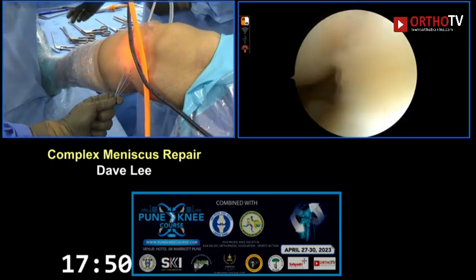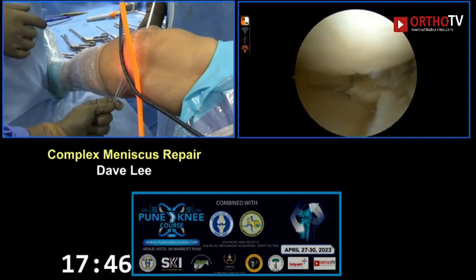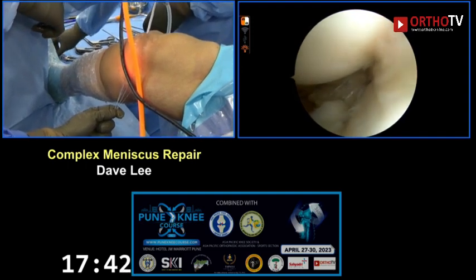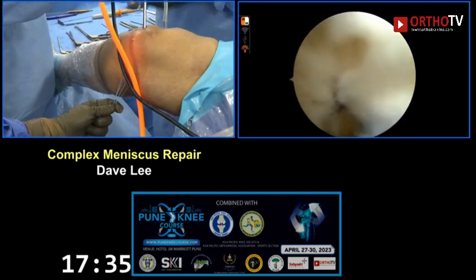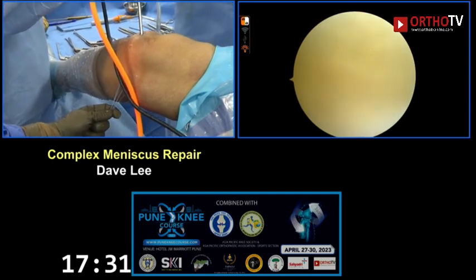Okay. Can we just have the inside? Usually I would do sort of three on the top and one underneath, and that's a ratio. Can I have the cannula again? No, sorry, the, yeah. Yeah, this one, I will need this.